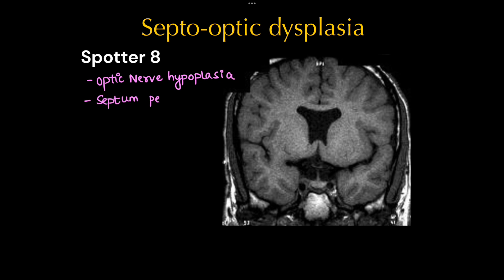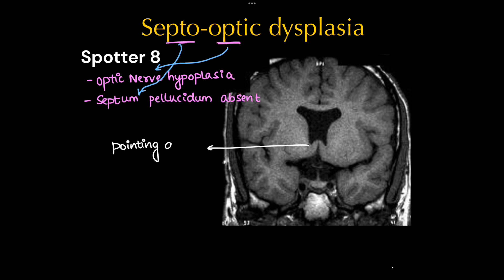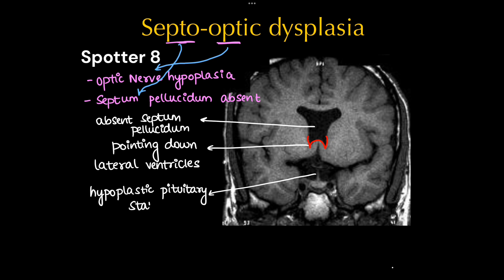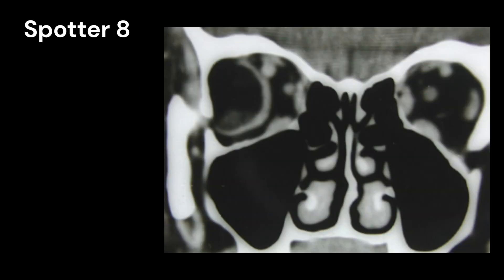This is a case of septo-optic dysplasia. Here we will have optic nerve hypoplasia and the septum pellucidum will be absent. Here we can see pointing-down lateral ventricles, which is classic, along with a hypoplastic pituitary stalk.